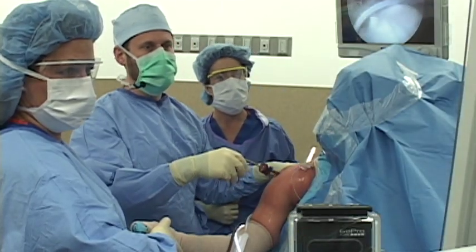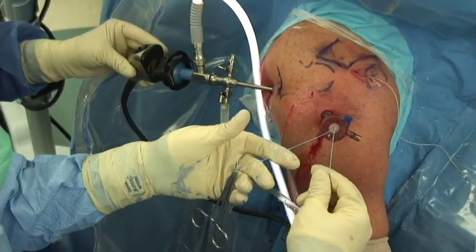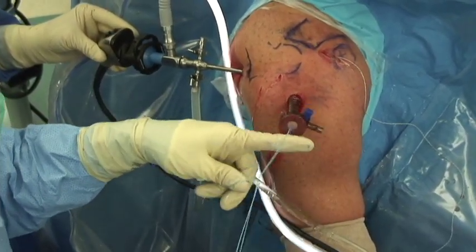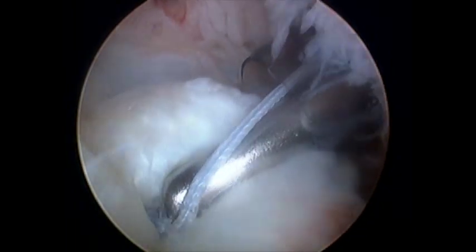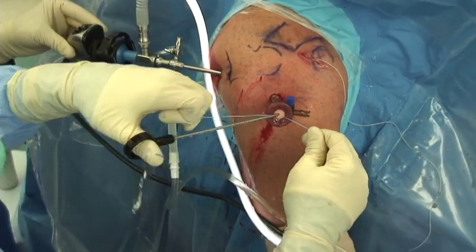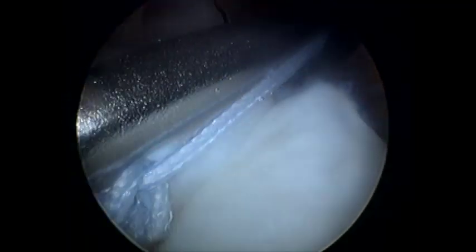Now we'll go gently over to our other two stitches, grab them, and repeat the process. I will put the knot pusher on one strand of the suture, hold it there, and now I'm going to tie a knot outside the body. Now I'm going to use this pusher to push the knot down onto the tendon. You can see how it indents the tissue, and that's how I know that it's tight enough. Then again, one additional security knot to help lock it in place so it doesn't slide back out. There's the half hitch that we're using for security. We have two nice, tight knots.